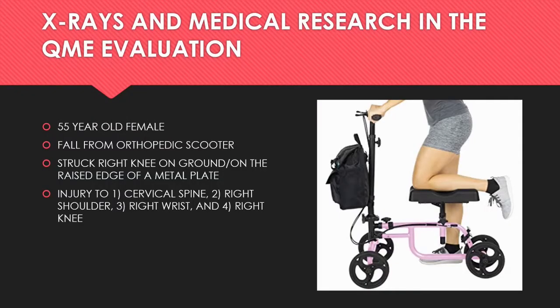Okay, so today's case involves a 55-year-old female. She is currently a high school teacher, and she suffered a non-industrial fracture of her right ankle. Now, this image here does not depict the right ankle, it depicts the left ankle. But let's just imagine that's the right ankle with a walking boot on the ankle with surgical hardware to stabilize fracture fragments of the distal fibula.